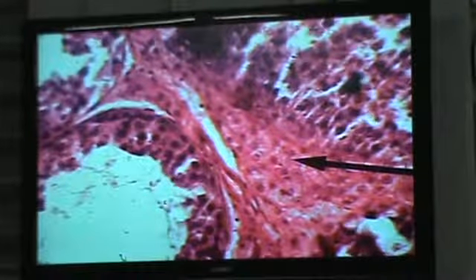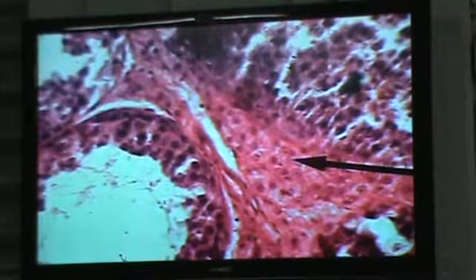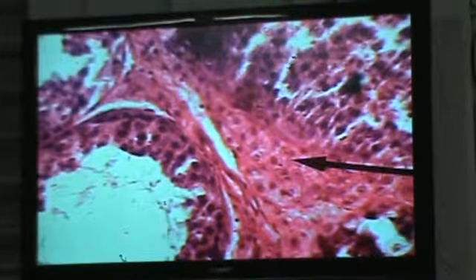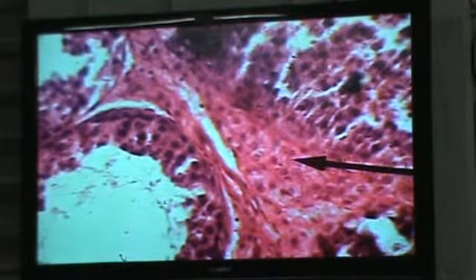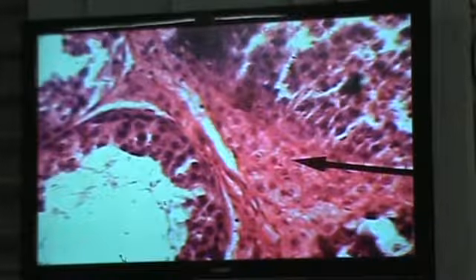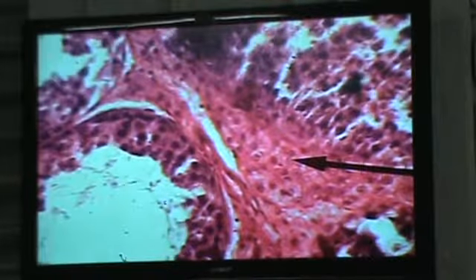But there's a spatial disorganization of all the organelles within, and it's failing now to convert that cholesterol into testosterone. So there's a spatial decoupling of the organelles within the Leydig cells, and you start to see organelles drifting to various parts. But everything needs to be like a factory line: this needs to pass to that. So very interesting that the cells sequester a lot of cholesterol but fail to produce the testosterone.